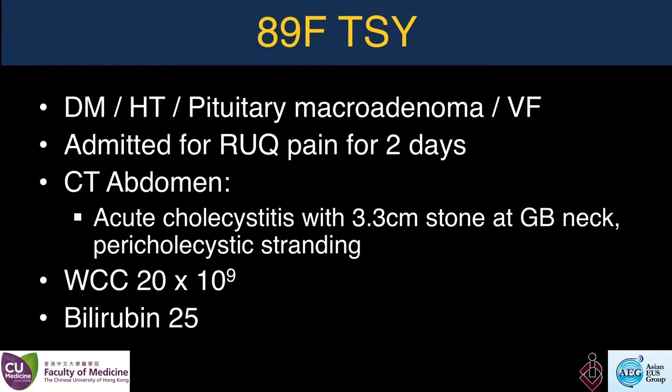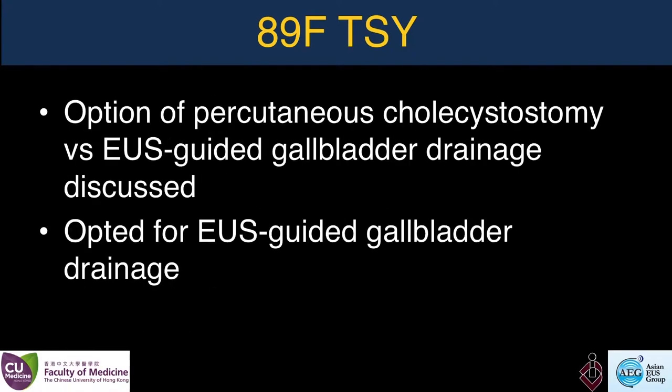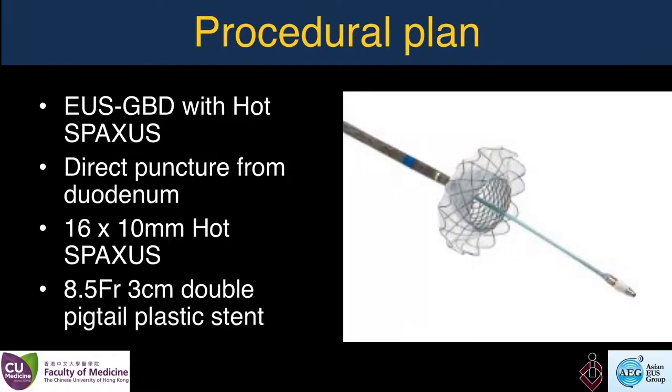Welcome to this video. In this video I will demonstrate the technique of performing EUS-guided gallbladder drainage in a patient that is at very high risk for cholecystectomy and suffering from acute cholecystitis.